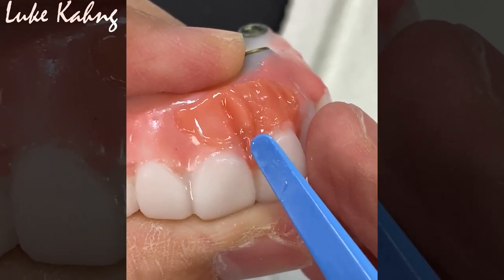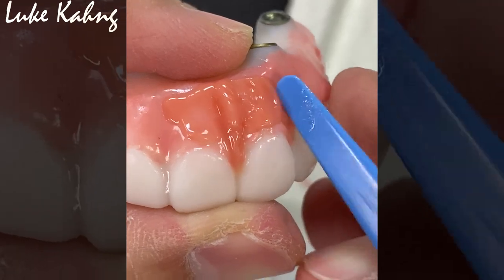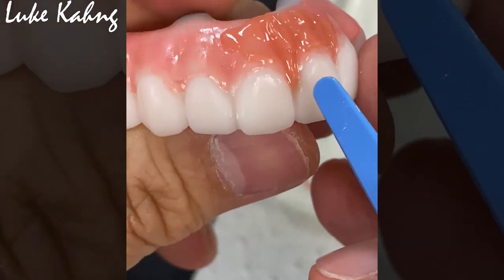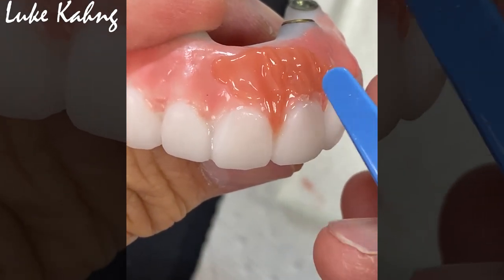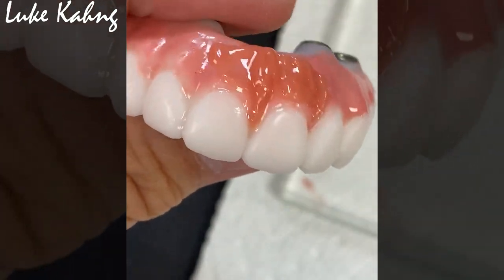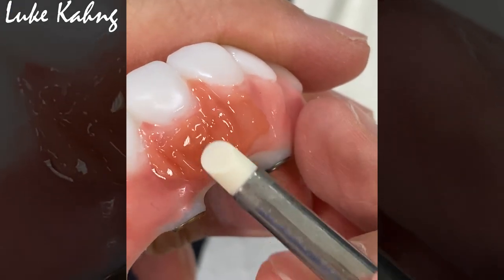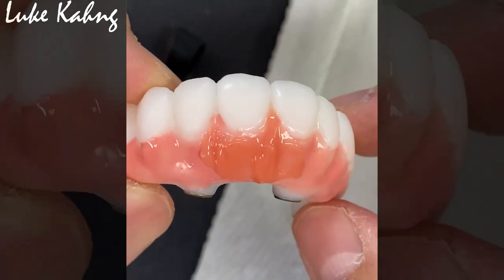I'm going to apply the same as just the other side, and I can show you later about the third one. How can I make the better color compared to this? Of course, I can use a little lighter than this or darker than this, so I don't have to make the smooth like this, but I'm going to show you later how to make the smooth for all the way here. Anyway, that one is a PMMA concept.